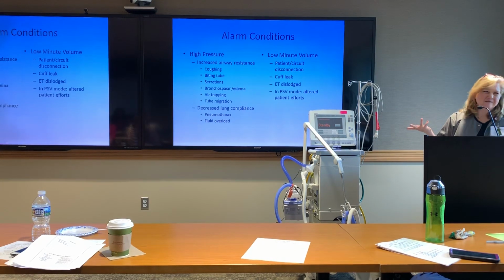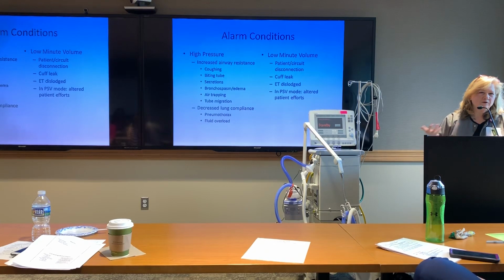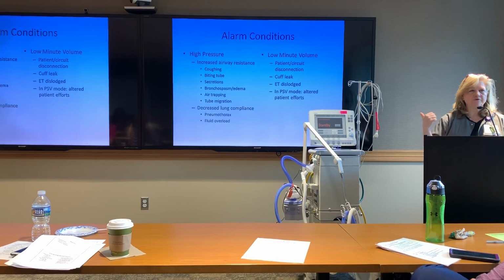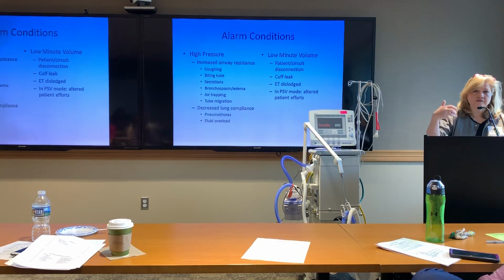Your high respiratory rate is another one that's on there. Again, more important when you're weaning somebody. You guys know the critical heart rate? If you had to say what the critical heart rate is for a patient, what is it? You don't want a heart rate ever above 140. I was told it was 140 because the heart doesn't have enough time to fill, so your stroke volume drops, right? Respiratory rate, you really don't want them higher than 35 in general because it's the same thing.